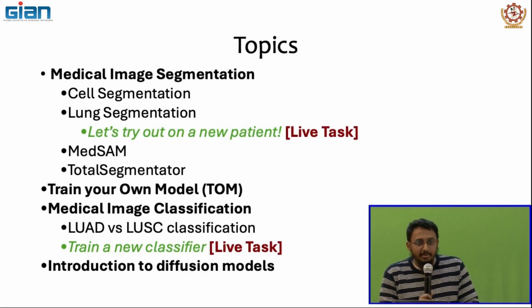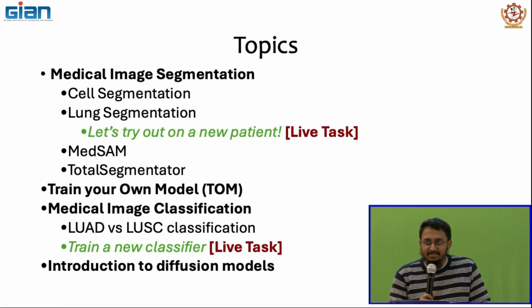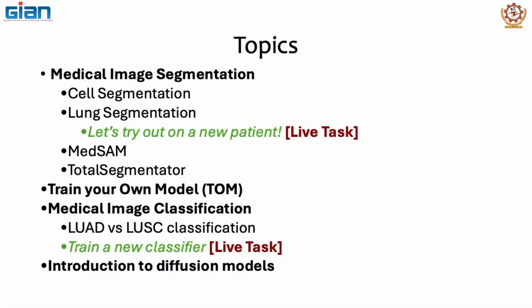Do you remember MedSAM? It was discussed in lectures before. MedSAM is a foundational model for medical image segmentation. Then you can also train your own model, and then finally you can look at the applied side of machine learning, deep learning, which is image classification.